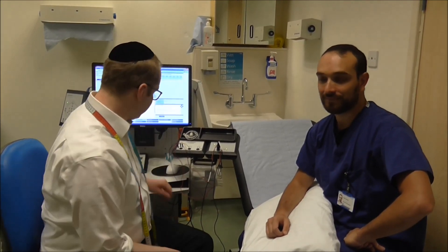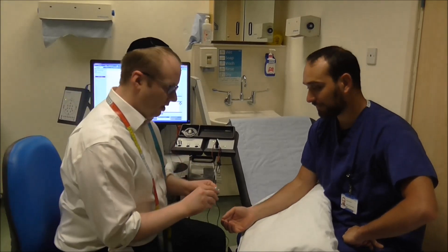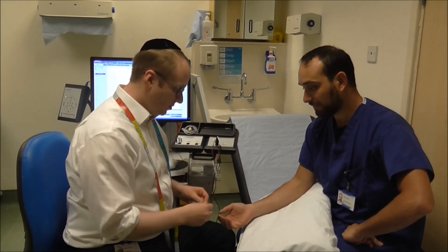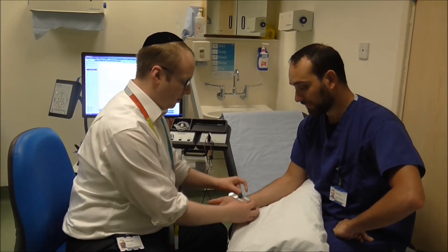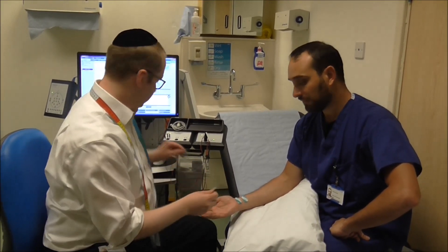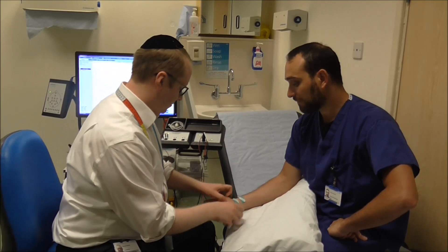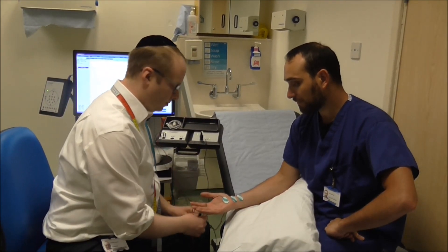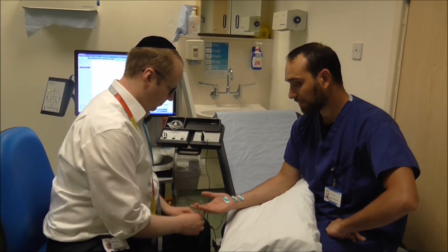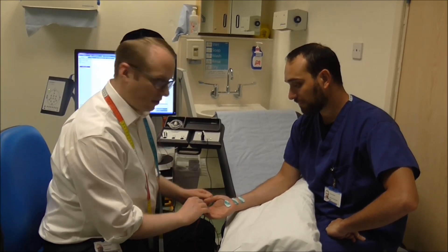I'm now going to demonstrate some of my tests on my colleague Paolo, who has very kindly volunteered his arm. I'm going to stick some electrical stickers over the course of one of his nerves, and I'm just placing some electrical probes on his finger.